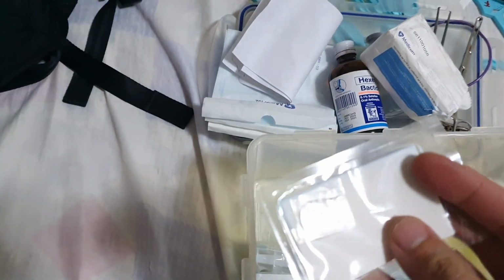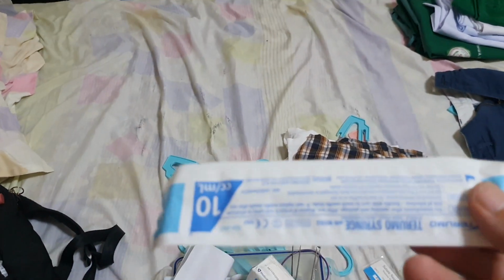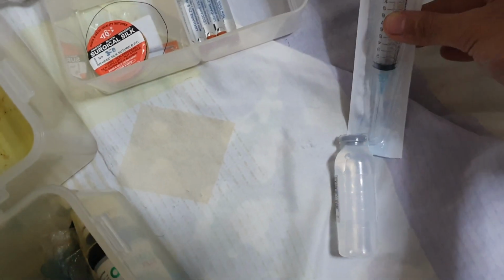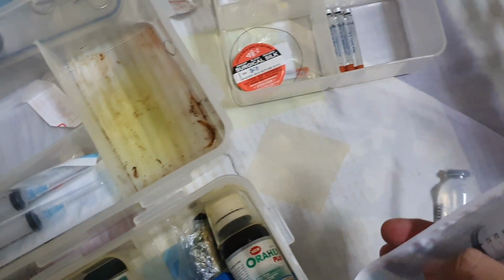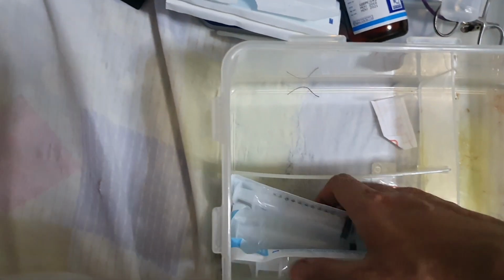And yeah, I have the suturing needle here. And this is the 10 milliliter, 10 cc syringe. This is used for irrigation. Oh yeah, this one and this and then this one. You get the NSS out, and then after that get the needle out, and then you do some irrigation on the extraction site. Very, very nice thing to do. This is what we used for irrigation as well.